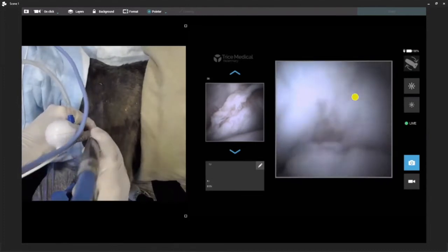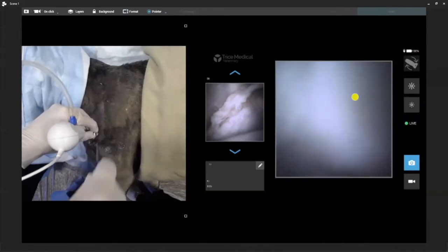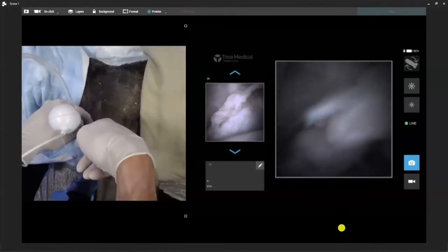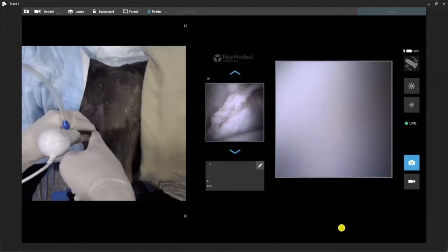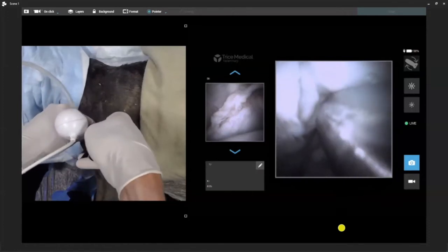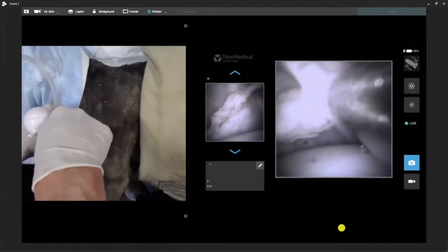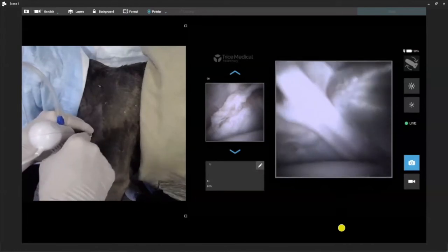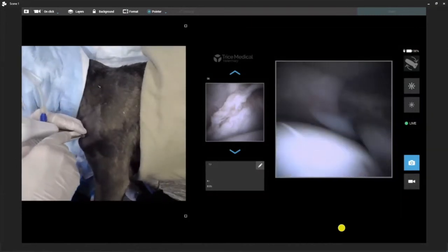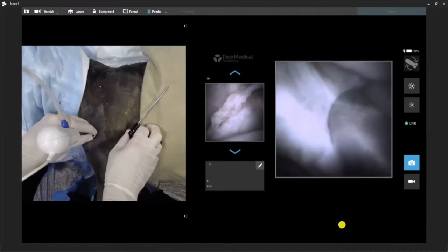Now we're going to slide our shaver out and take our scissors. We're working with doctors from other locations doing biceps releases — you can see very easily how that works. We can get our scissors in there if we want to perform a biceps release and get up to the biceps tendon itself. We can get to our subscap to do radiofrequency if we want. We can treat the MGL, put anchors in if needed, and treat an OCD area if we're shaving. Without a doubt, the majority of any procedure we can think of, we can get to and treat very nicely.